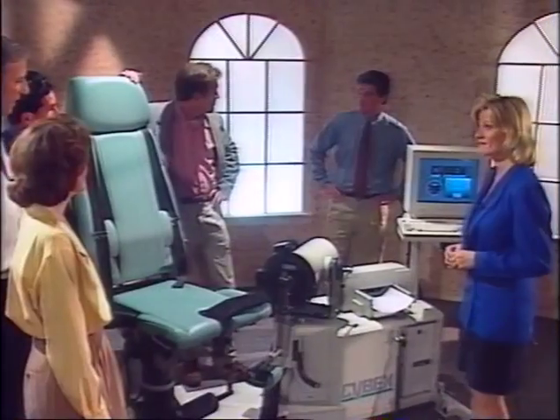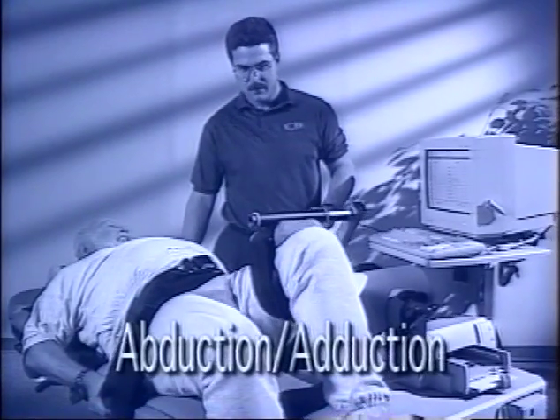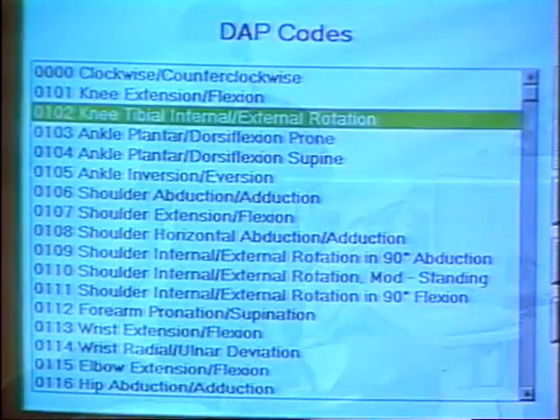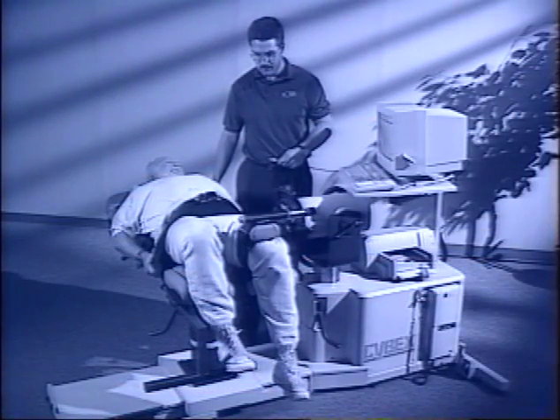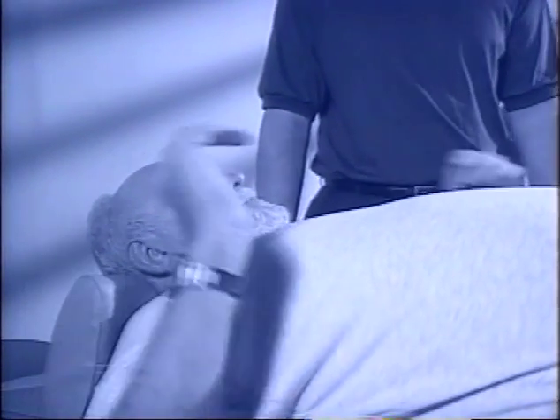What about hip patterns? We see a lot of those. NORM has 3 hip setups: abduction adduction, flexion extension, internal external rotation. Regardless of the pattern, whether hip, knee, ankle, or wrist, the NORM system is designed to accommodate the ever-increasing geriatric population. In fact, we've found that patients are actually progressing faster on the NORM system. Now, Patrick mentioned that he handles a lot of sports-related injuries. Well then, I'm sure quick shoulder setup patterns are of interest to you.